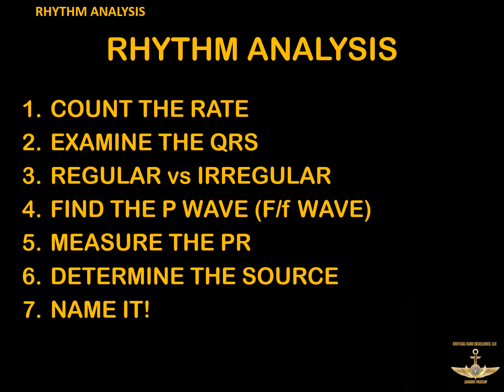Clinically speaking, as you start doing this, it's really important that you don't get tunnel vision on one really ugly thing about a heart rhythm, with really big ST elevation or really tachycardic or whatever, and that every single time you're doing this, you're going through this little process to make sure that you're seeing everything about their rhythm you need to. So I always advocate that people go through this the same way every single time.